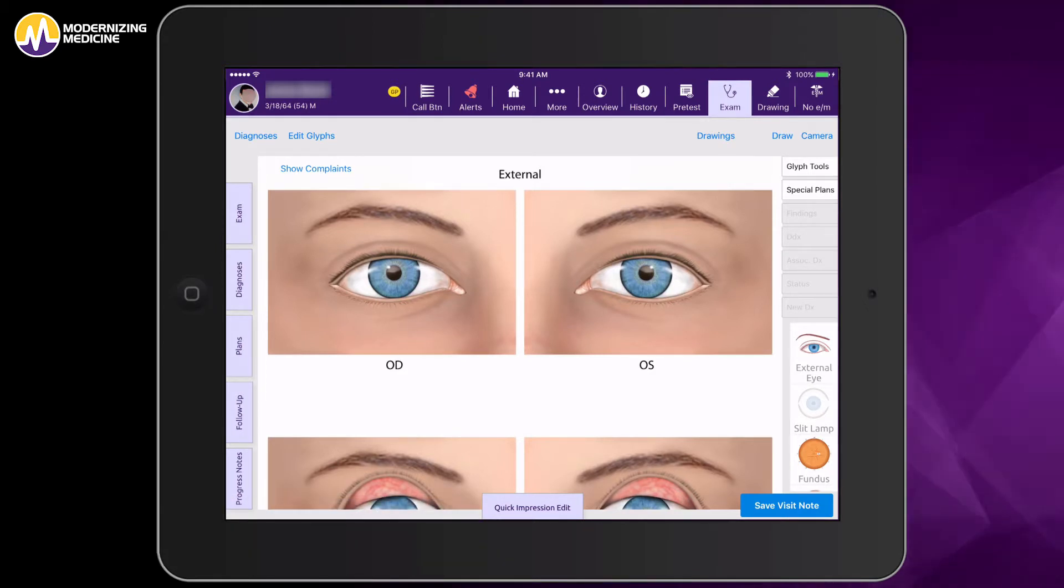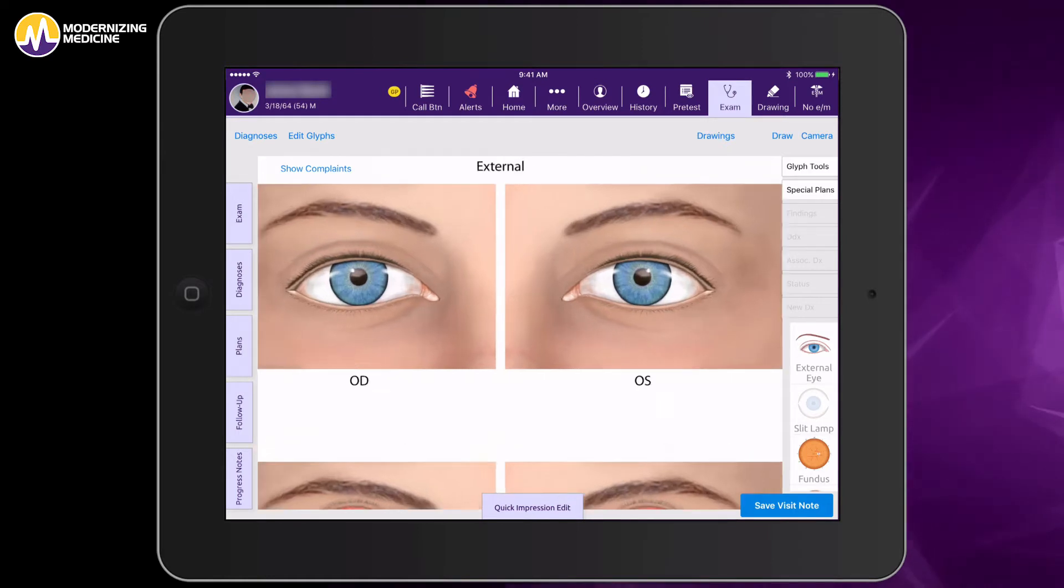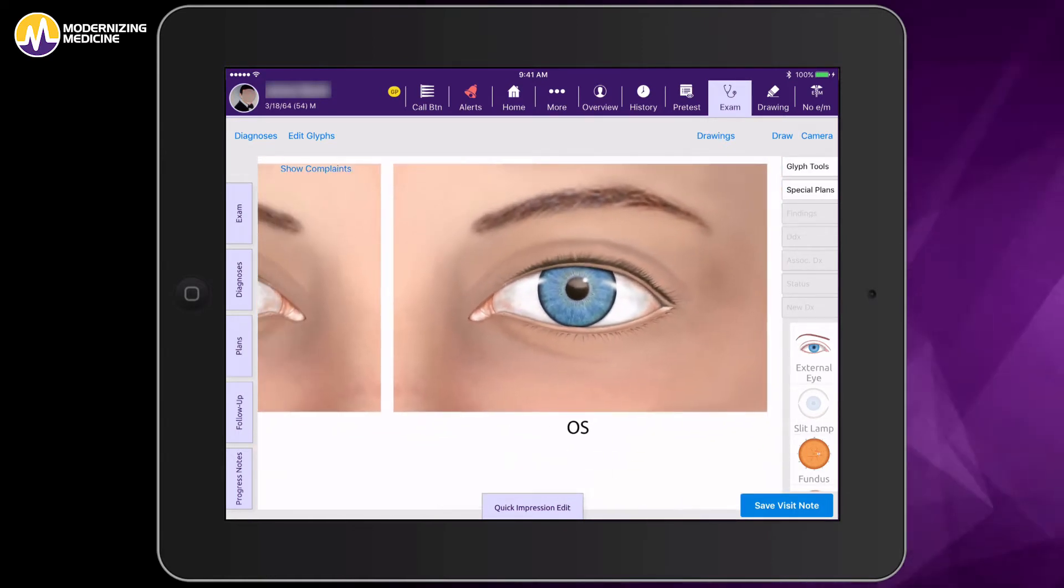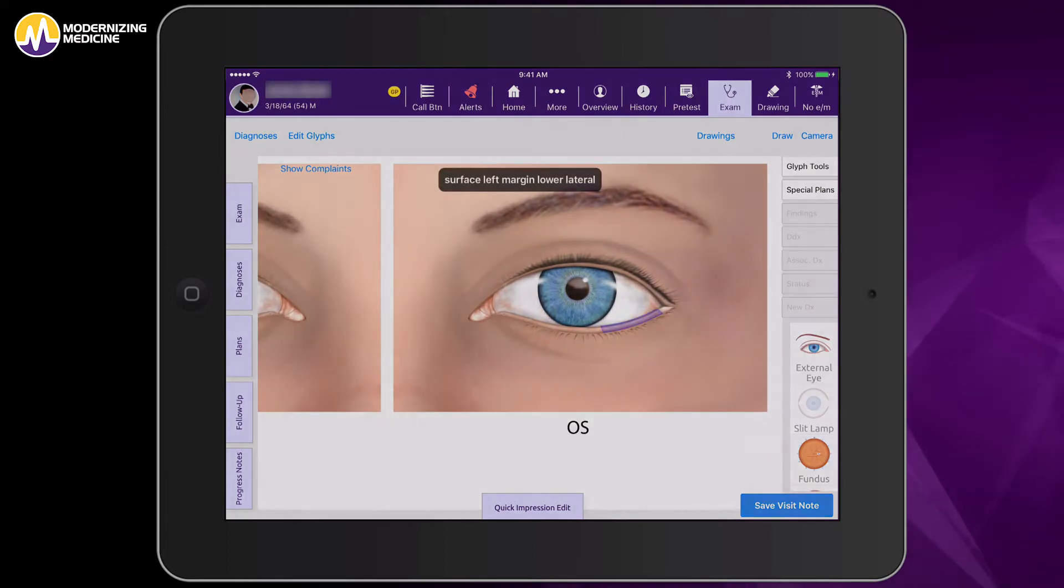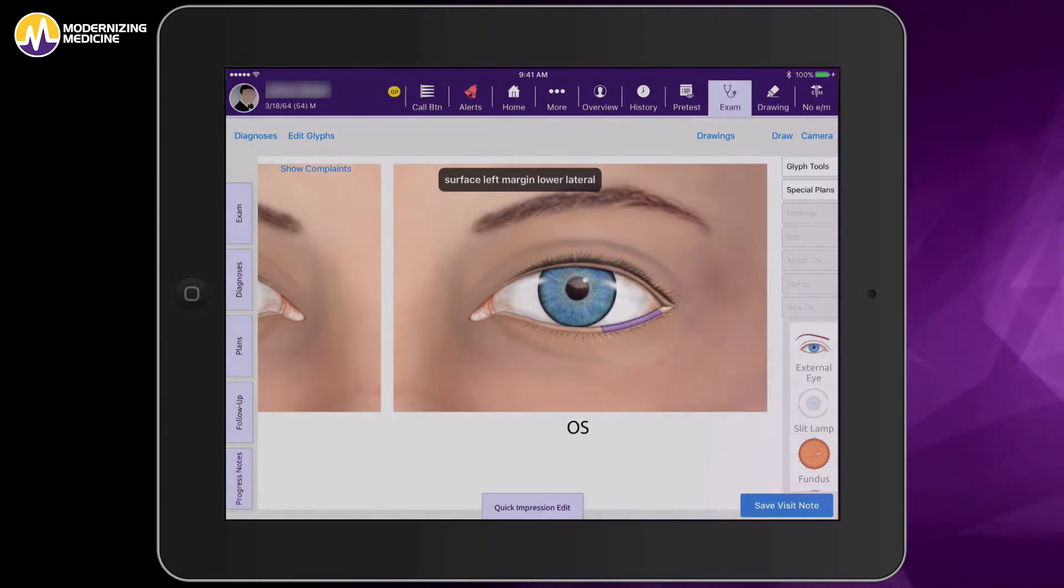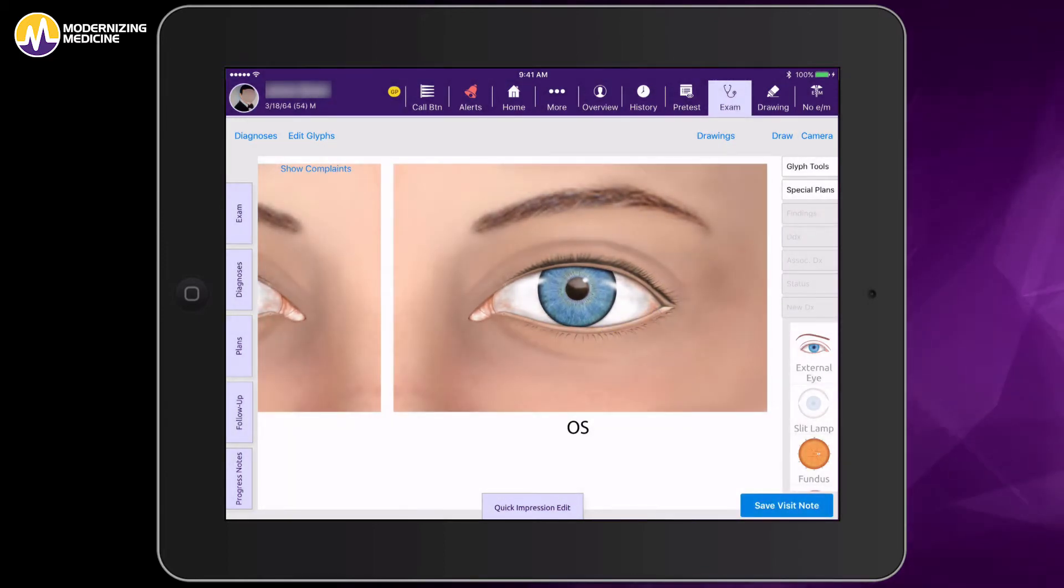In the exam, I can pinch and zoom on any diagram and it's set up for ICD-10 specificity. You'll see if I hold my finger down, it highlights where I am.